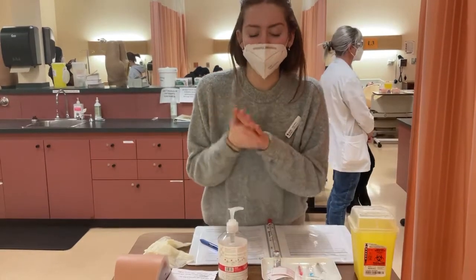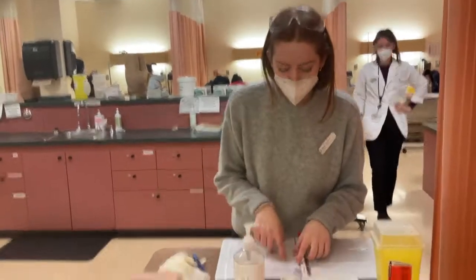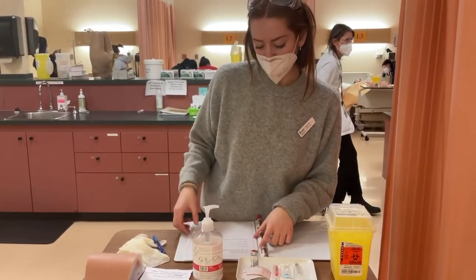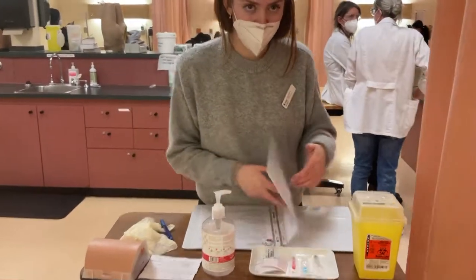Before medication administration, you always want to wash your hands first. Today, I will be administering thiamine intramuscularly at 8 a.m. for my patients for Wernicke's encephalopathy.